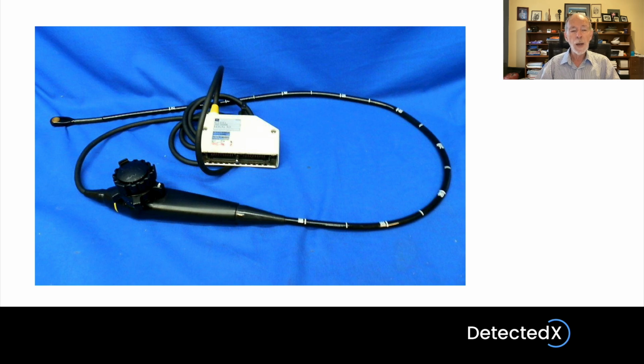The big thing about these invasive probes is that you get the probe very close to the tissues that you're imaging, which means you can use high frequencies. So the image resolution is going to be very good, and that's because the ultrasound only has to travel a short distance through the tissues. As it happens, you also get high frame rate. For the same reason, the ultrasound's only travelling a short distance, and therefore you can repeat the transmit pulses rapidly and get a high imaging rate.